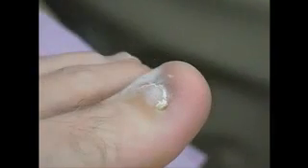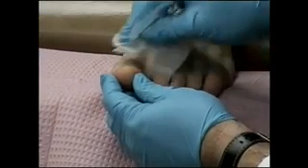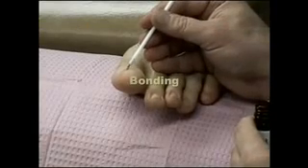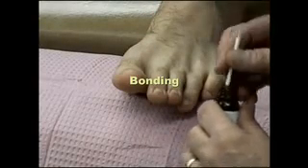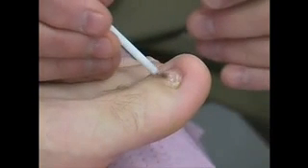Okay, so at this stage, we've got the nail smoothed down a little bit. It was warming up because there's not a whole lot of nail left. What you want to do after you've debrided your nail is clean it off with an alcohol swab. We're going to put the Kery Bond on. And with the Kery Bond, you want to make sure you get the entire nail plate and also the nail bed where there's no nail.